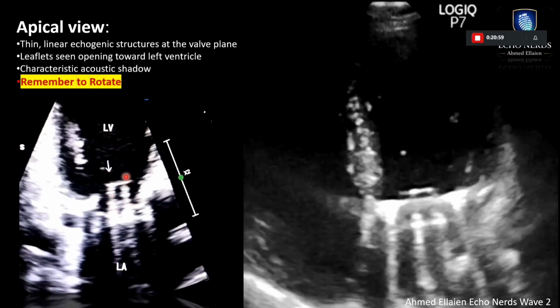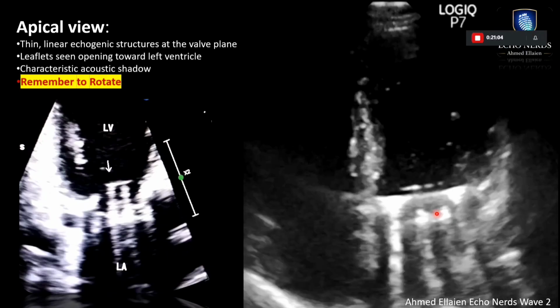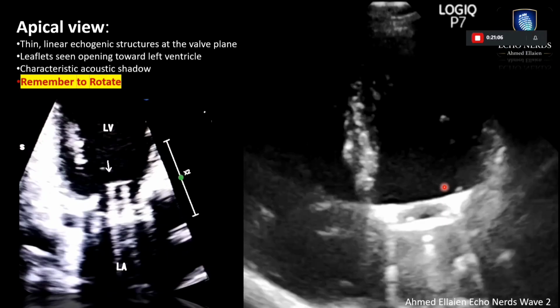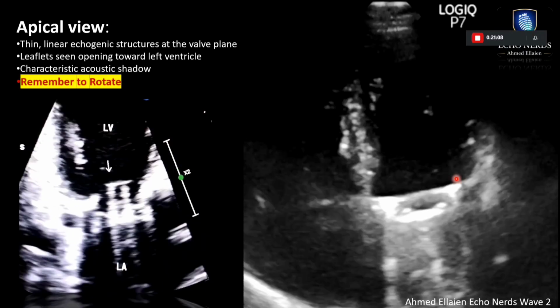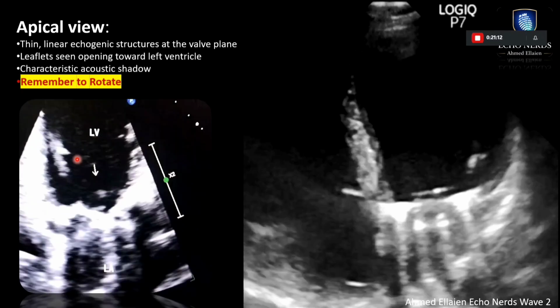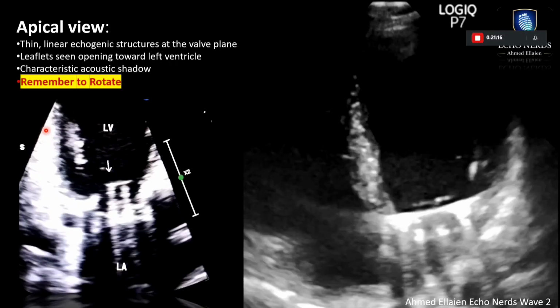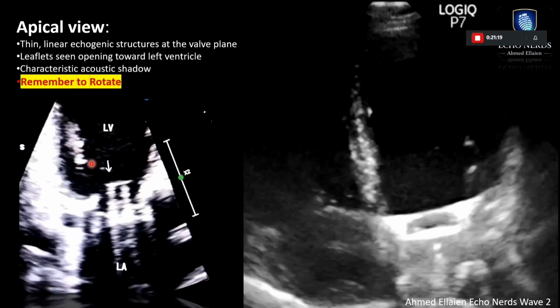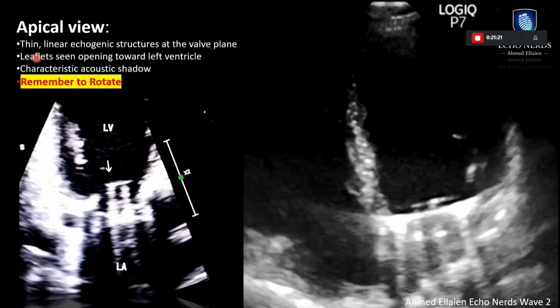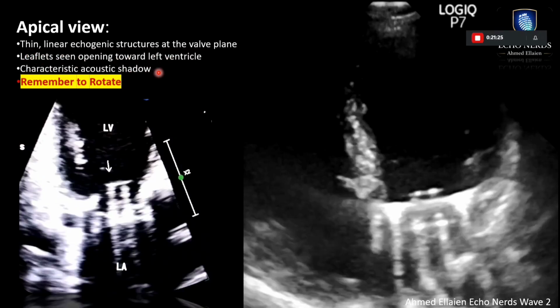They are perpendicular here, so the valve is opening, while when they form a wide V shape, this means that they are closing. And we can appreciate the full range of movement of the two discs. So these are normally moving discs. Leaflets are seen opening towards the left ventricle with characteristic acoustic shadowing.